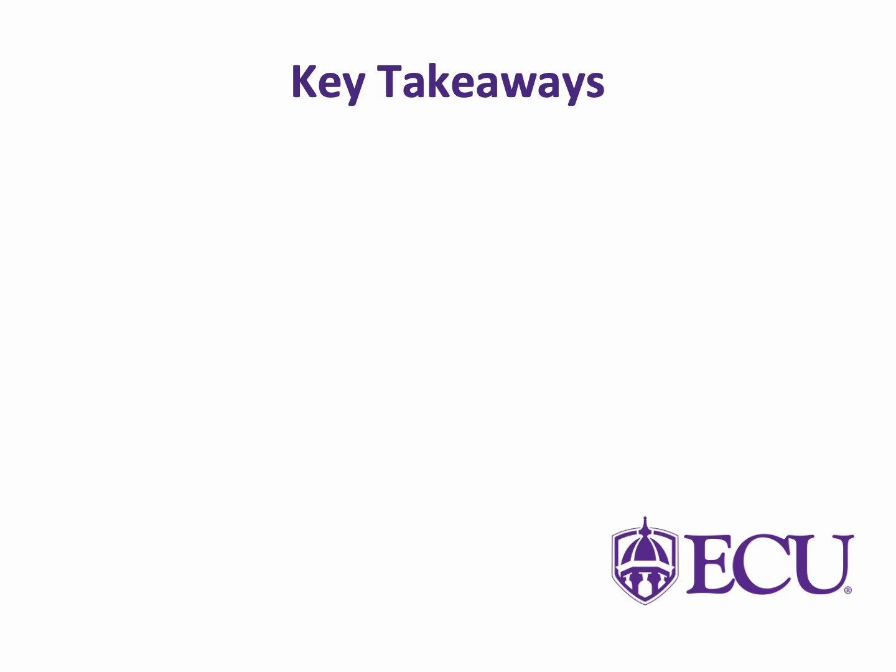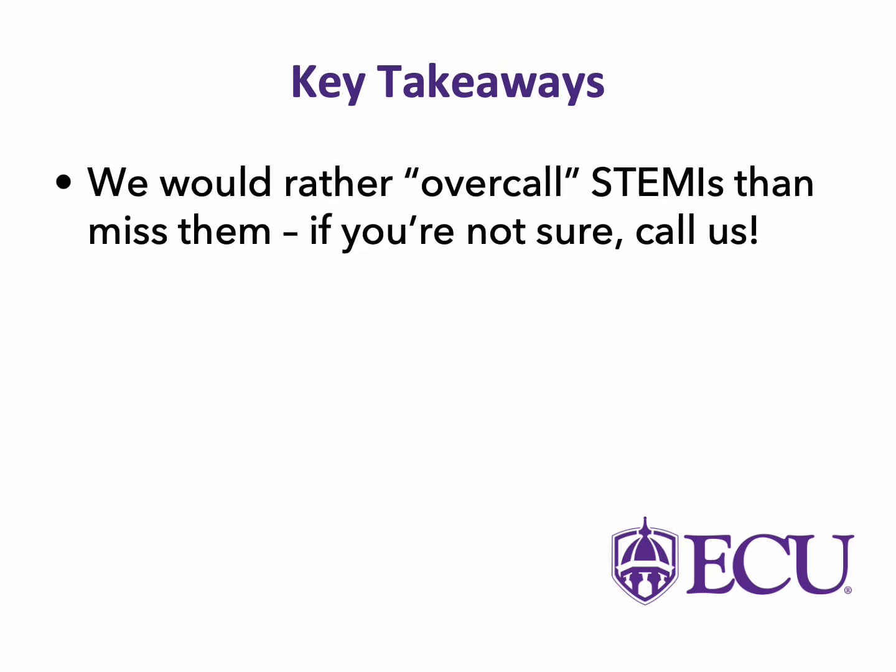So to finish up, back to our key takeaways. Again, we'd rather overcall STEMIs than miss them. If you're ever not sure about something, feel free to give us a call. We'd rather you err on the side of calling a STEMI in the field than not calling it. But at the same time, we should be diligent and make sure we understand things like left bundle branch blocks and benign early repolarization and know that context does matter. You should look at what your patient looks like, their age, their risk factors, their symptoms, and see if it all fits to make a STEMI make sense.